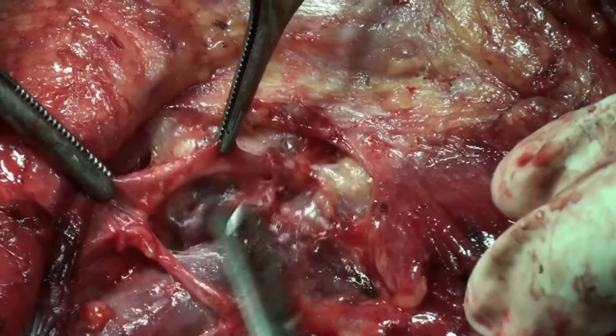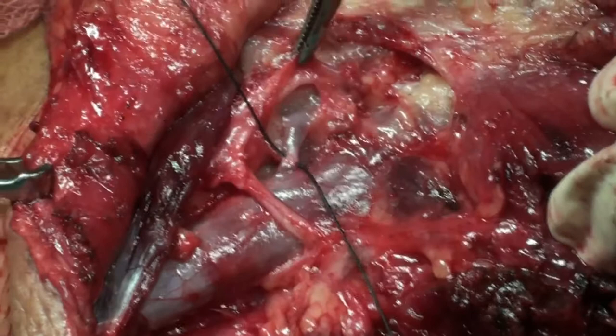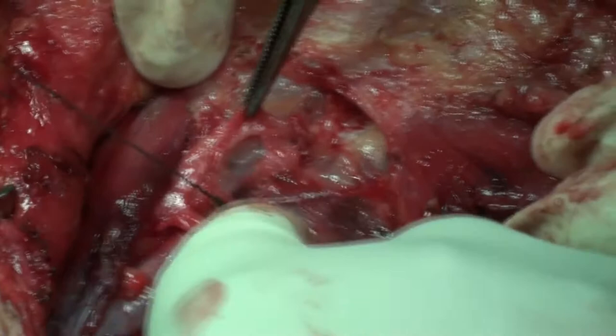Yes, please. Can you see that? Record the whole thing. I've deliberately put a granny first to let it slip. Now I'll put a proper knot.